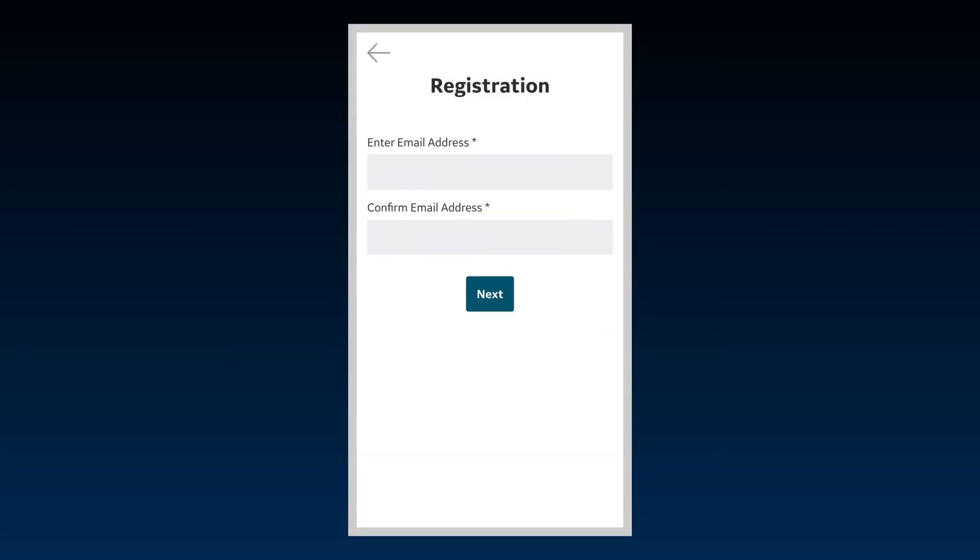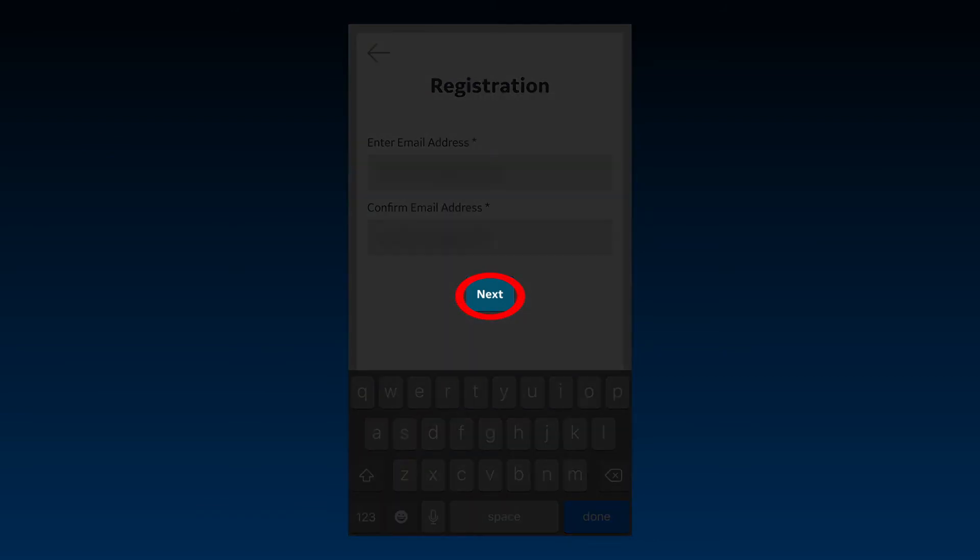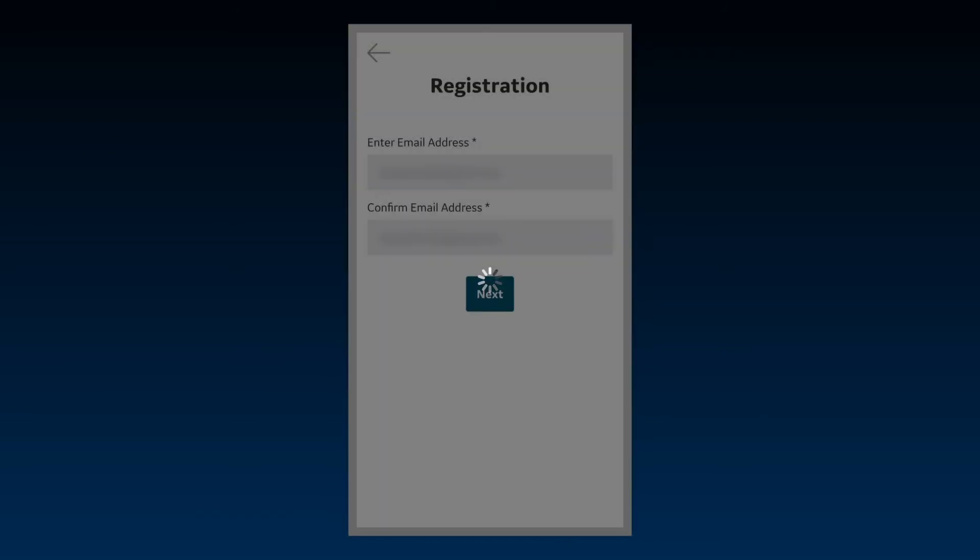This will take you to a registration page for the new user, where you can enter an email address and password to register an additional user. Click Next and follow the prompts to add the user.